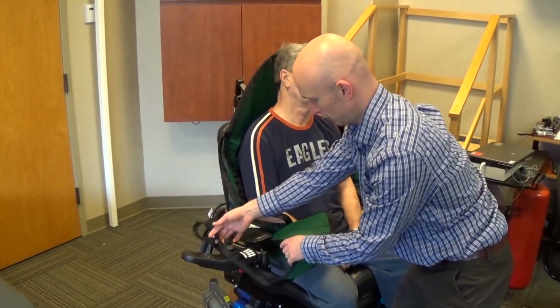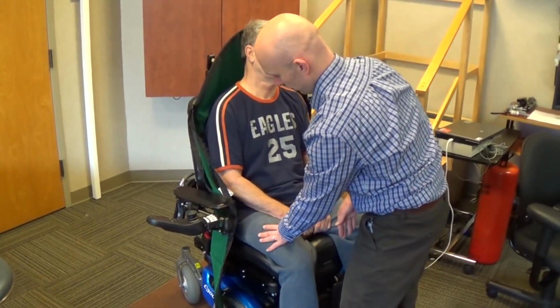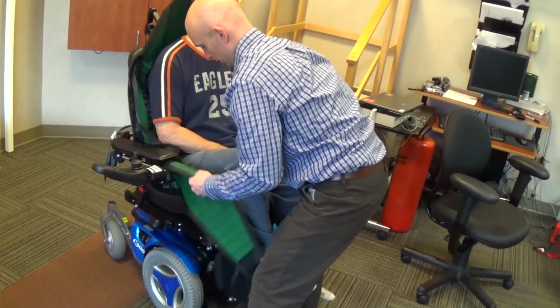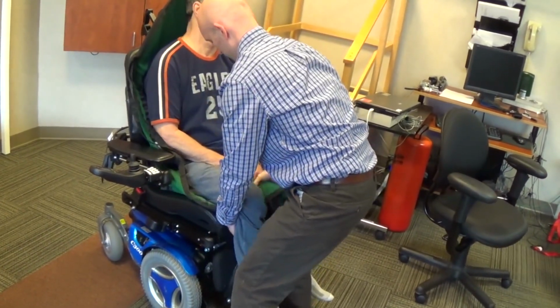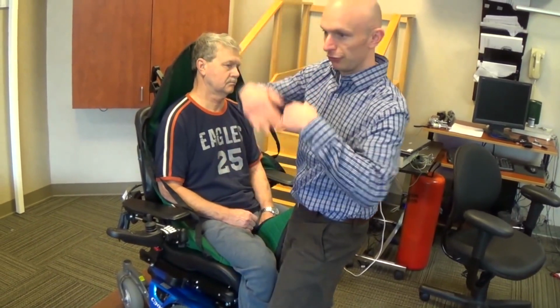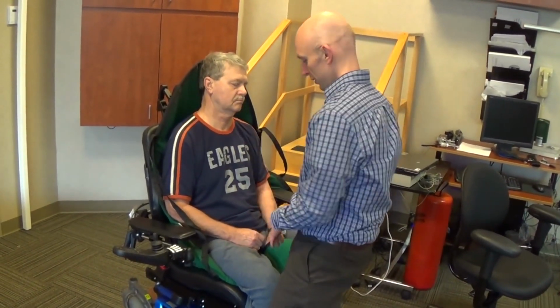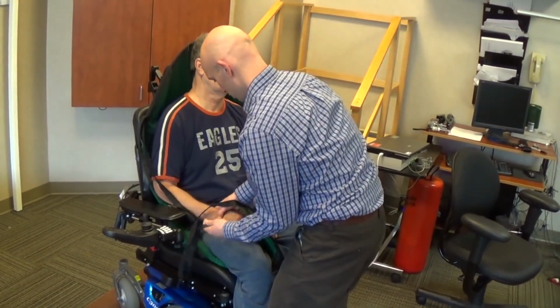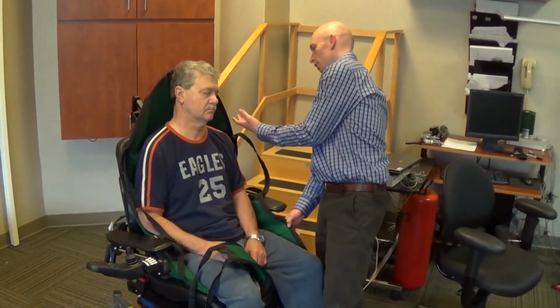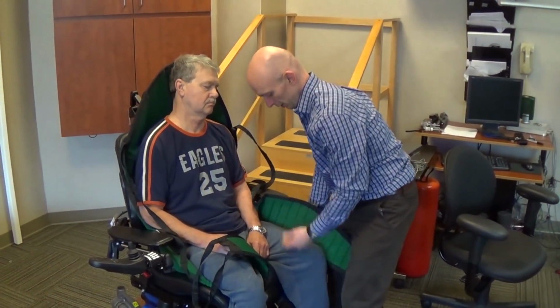With the leg loops, trying to make sure there are no twists as you place it under the person's leg. Lifting the leg up and then pulling the leg strap through. The higher you can get the leg strap up, the less the person will slide through the hole that's created by the divided leg sling. Just go on the other side. If the person has poor trunk control, you can also have the wheelchair tilted posteriorly so their back is weighted.